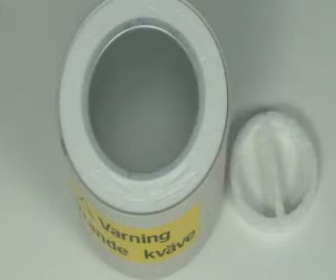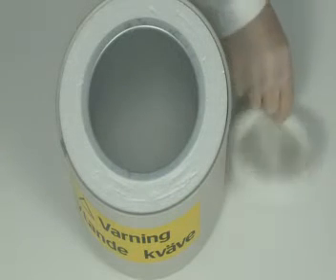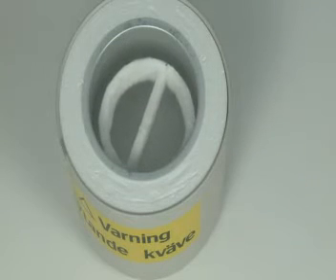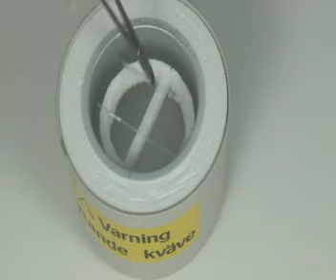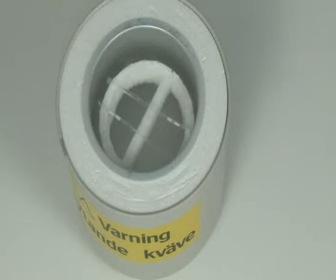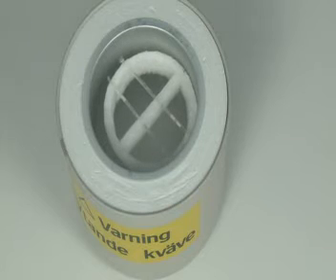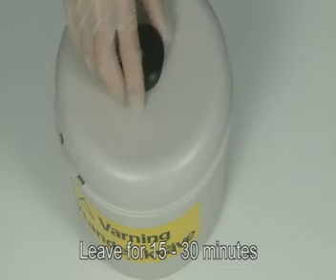Remove the straw from the refrigerator and place the straw on a cryo floater on the surface of liquid nitrogen. Be sure not to touch the straws with your warm hands. Leave for 15 to 30 minutes.